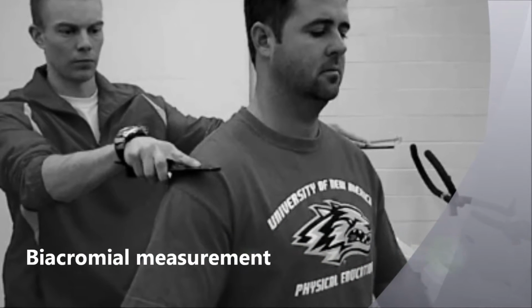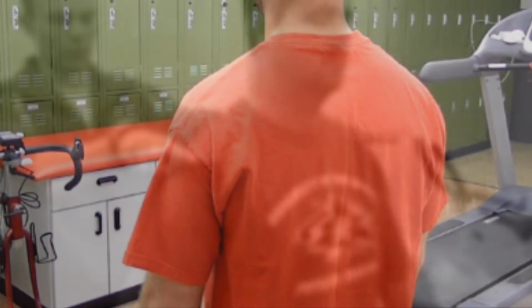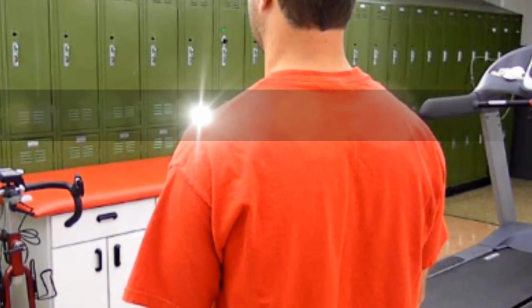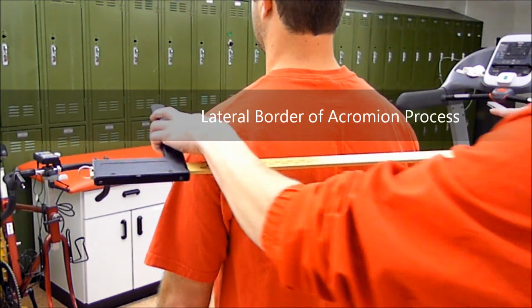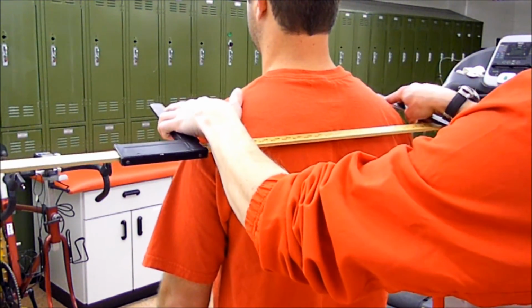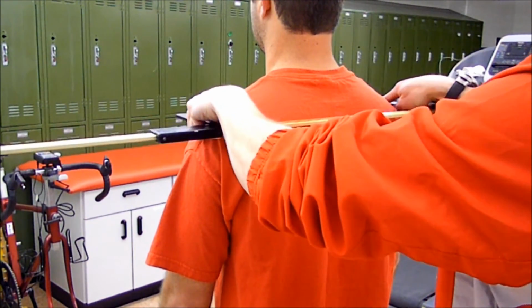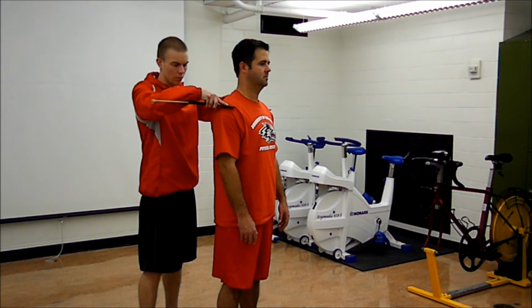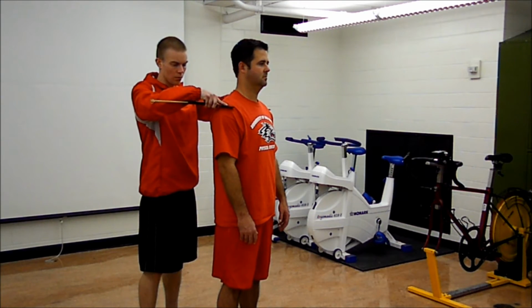The anatomical reference points for the biacromial skeletal diameter measurement are the lateral borders of each acromion process of the scapula. The participant should be standing upright with the arms hanging at the side with the shoulders relaxed. The technician should stand behind the participant and place the caliper blades horizontally on the lateral borders of each acromion process while applying firm pressure to compress the fat, muscle, and skin.